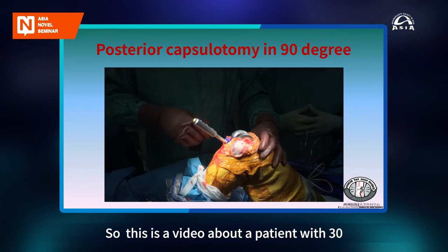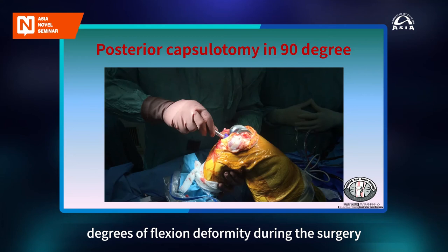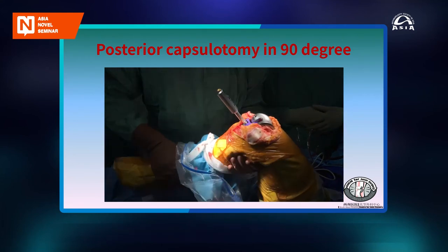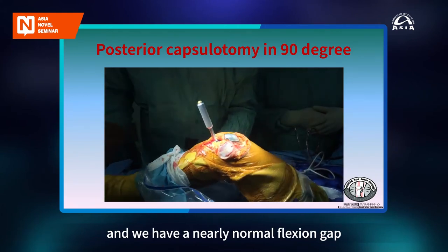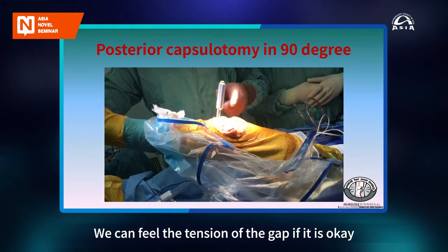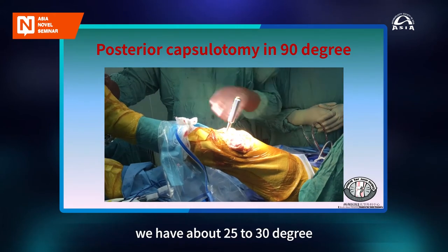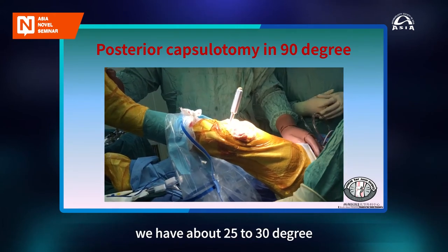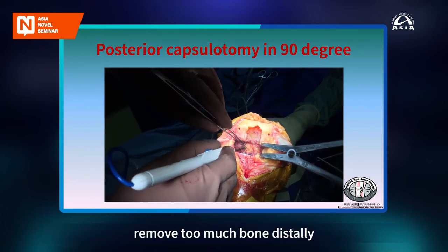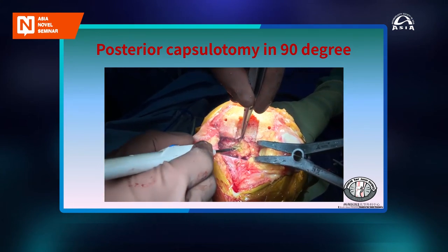So this is a video about a patient with 30 degrees of flexion deformity during the surgery. We can see that after the femoral bone cut, we have a nearly normal flexion gap. We can feel the tension of the gap, it is okay. There is no opening medially and laterally, but in extension, we have about 25 to 30 degrees of flexion deformity. So we do not want to remove too much bone distally. So we do a posterior release with the Insall technique.